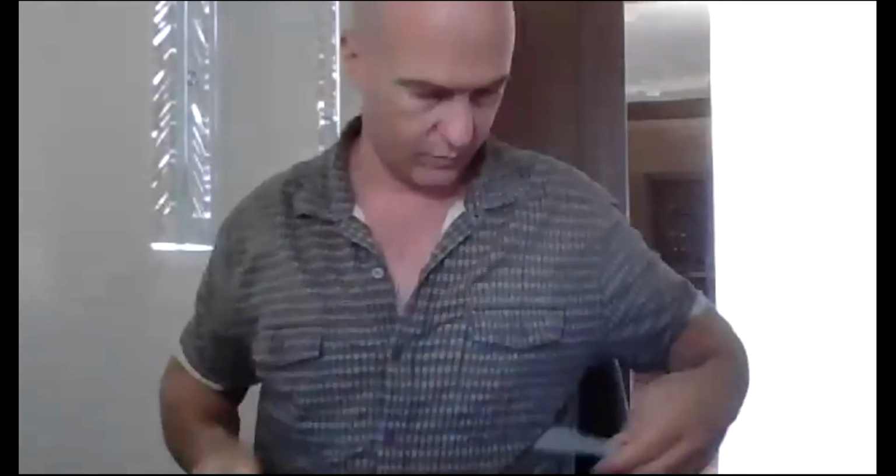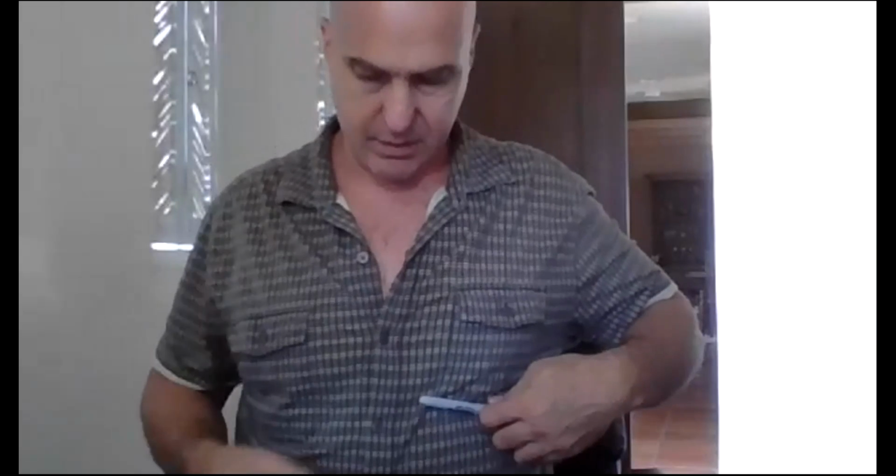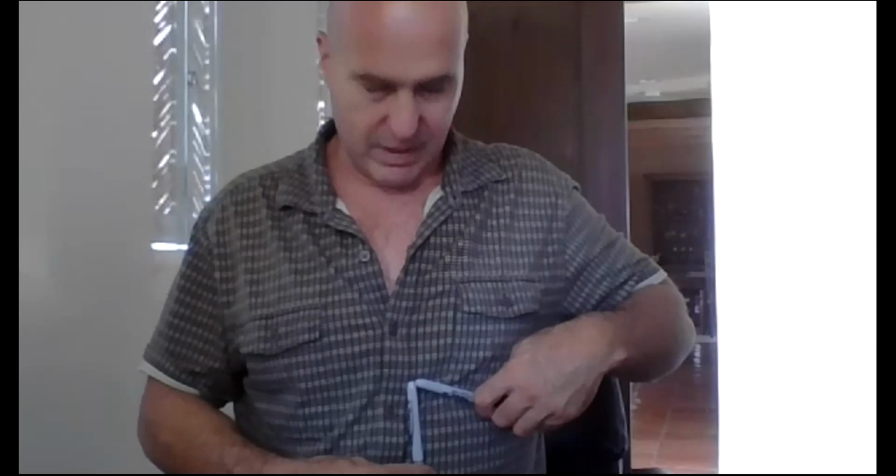Remember, from my splenic vein coming from my spleen across, my superior mesenteric vein is coming from my belly up. They are meeting right about here. It's all backwards to me right now. That is, this point right there is the confluence. That is where the pancreatic head is.